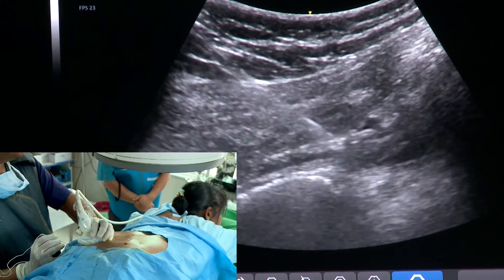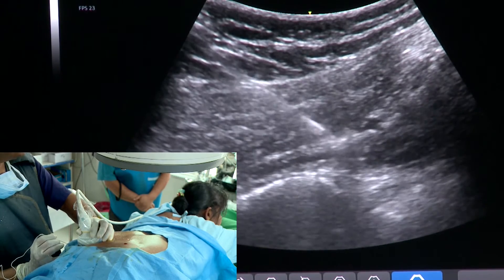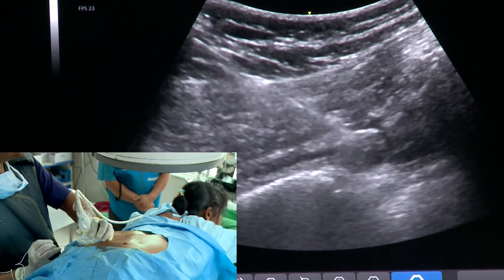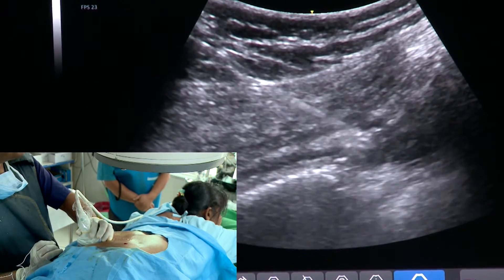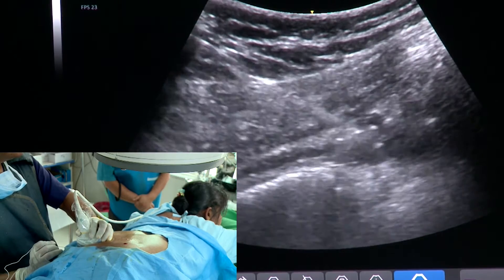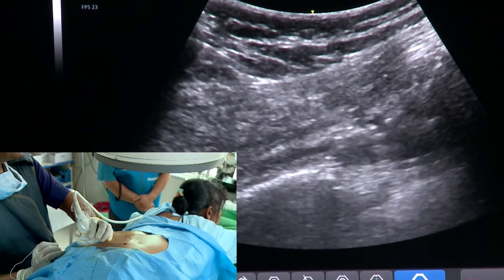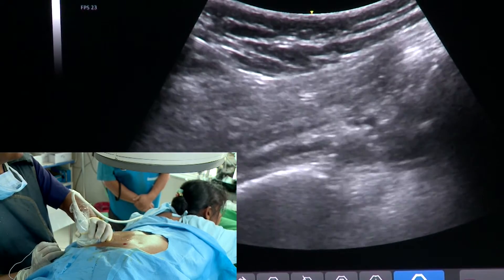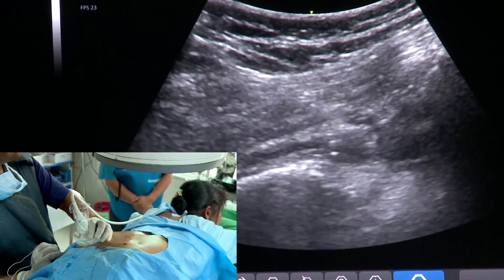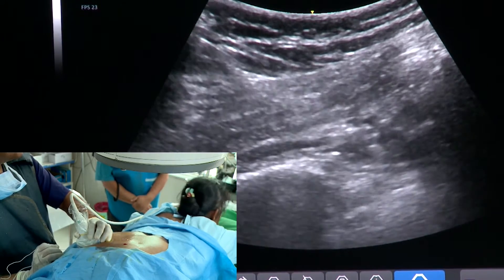Now what I will do is go closer — you can see the tip of the needle there. I can change the direction to puncture at a different side of the piriformis, going a little bit more medial. You can see this is called the jump sign; the muscle contracted when I punctured it. So I am puncturing again, more medial, more medial.